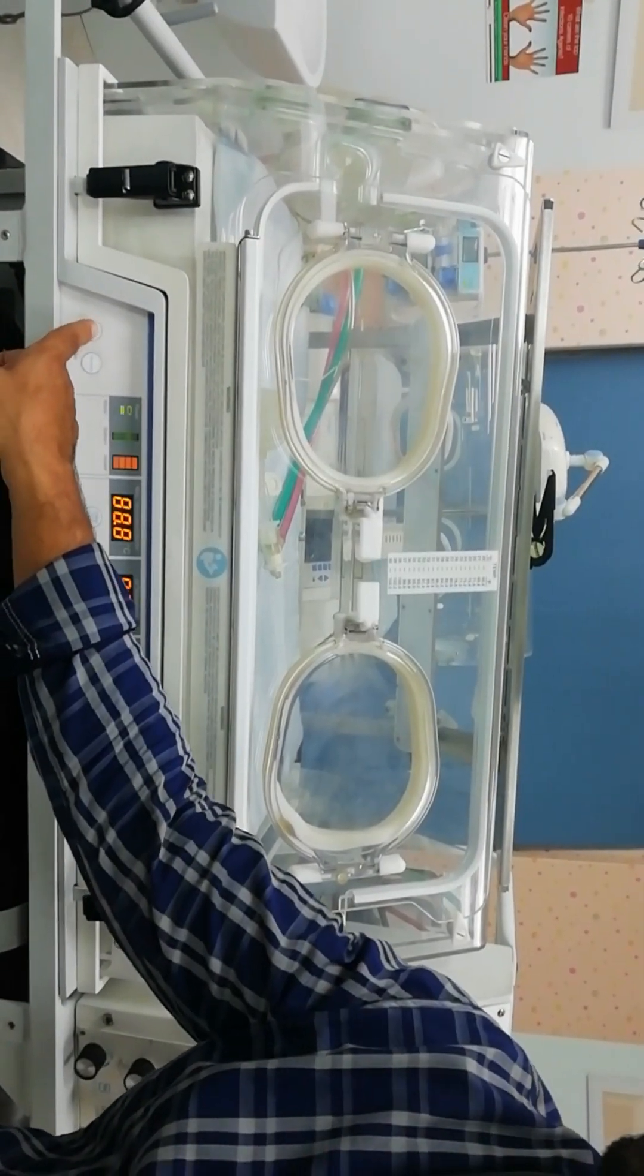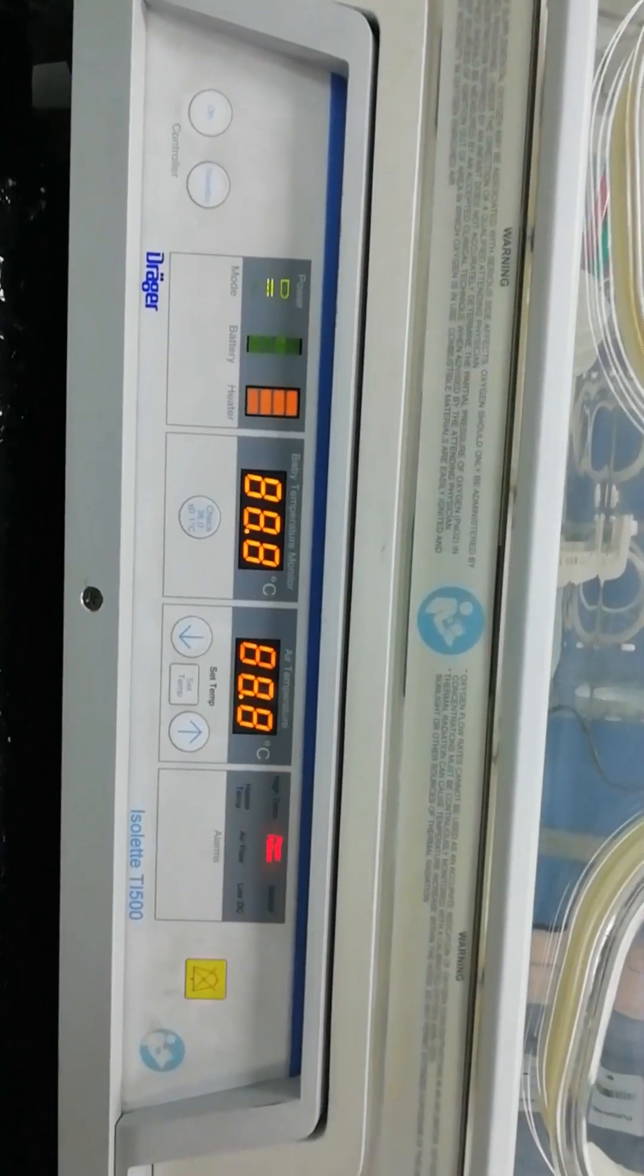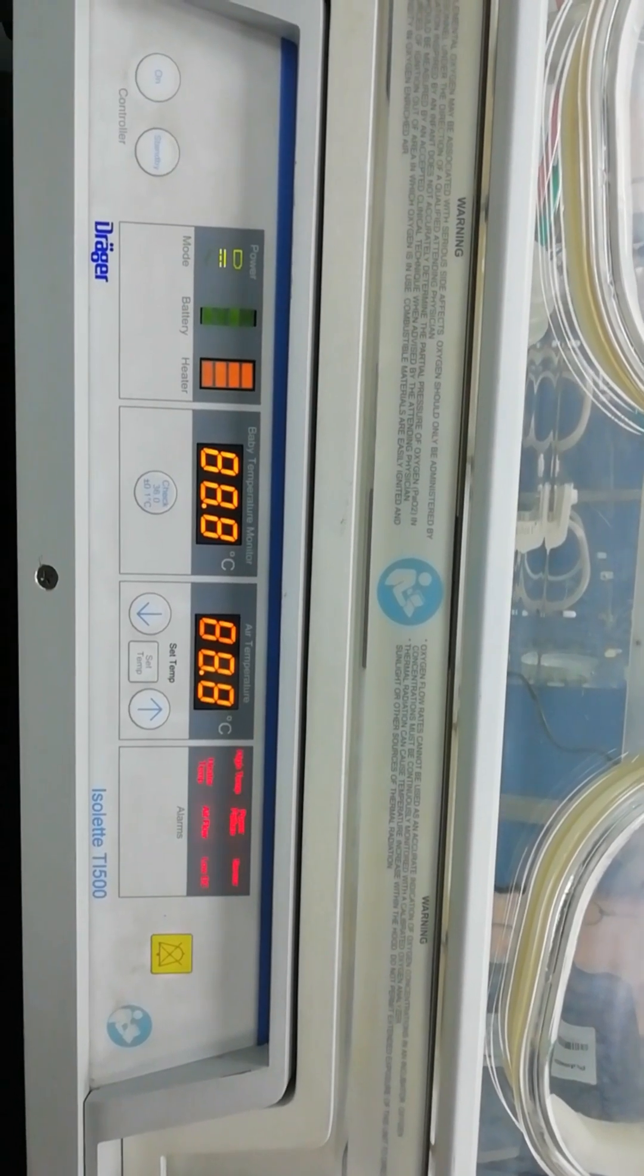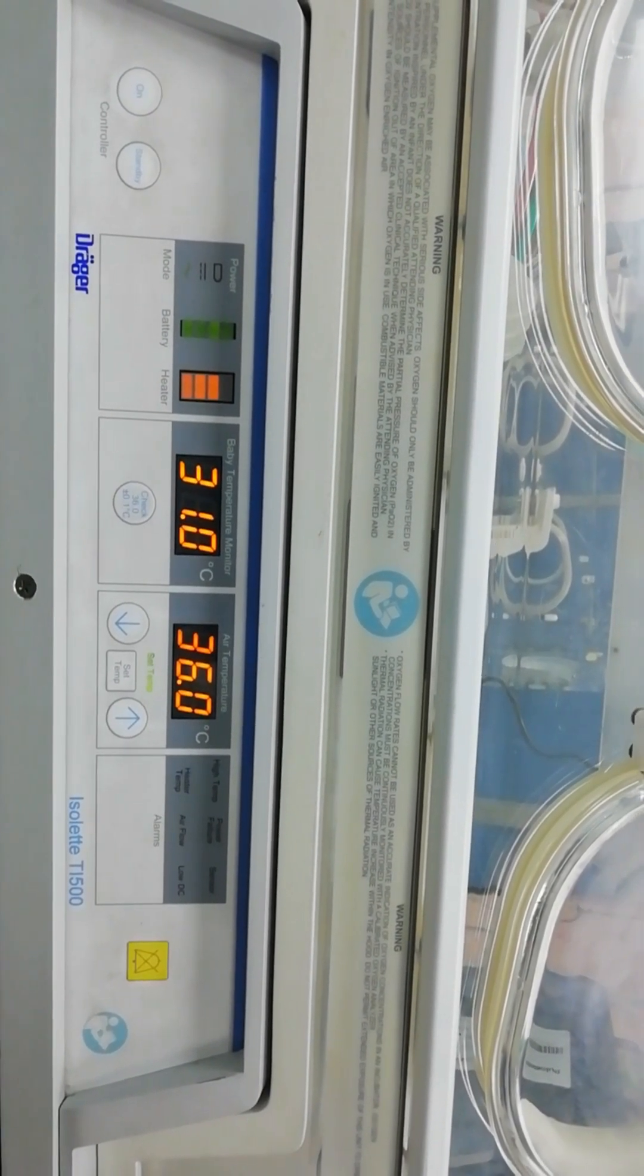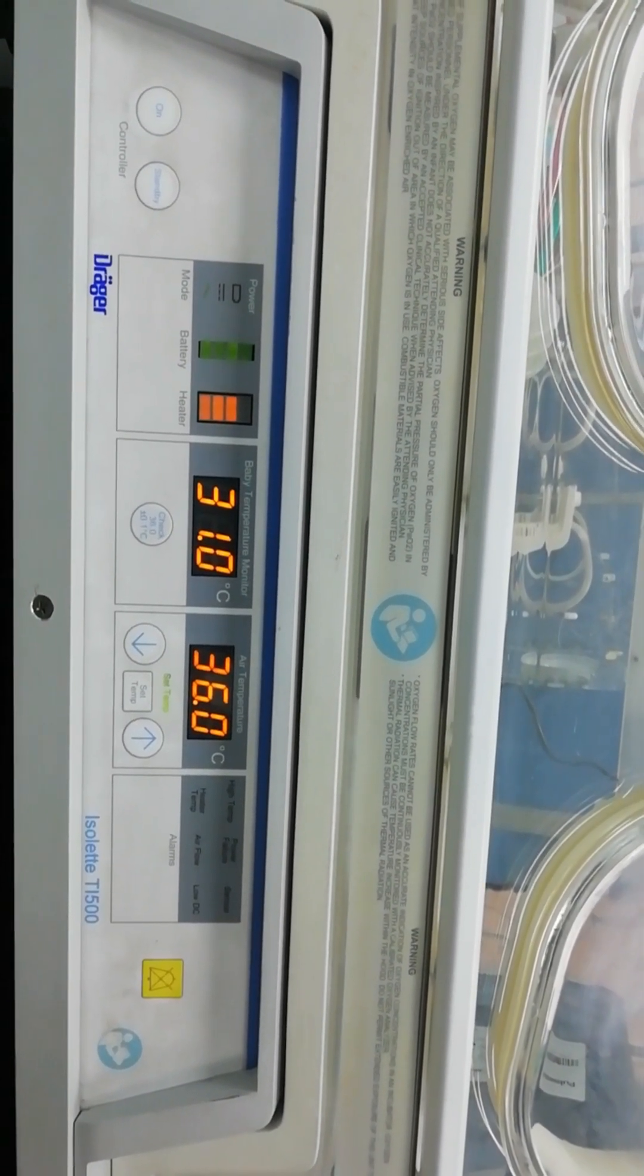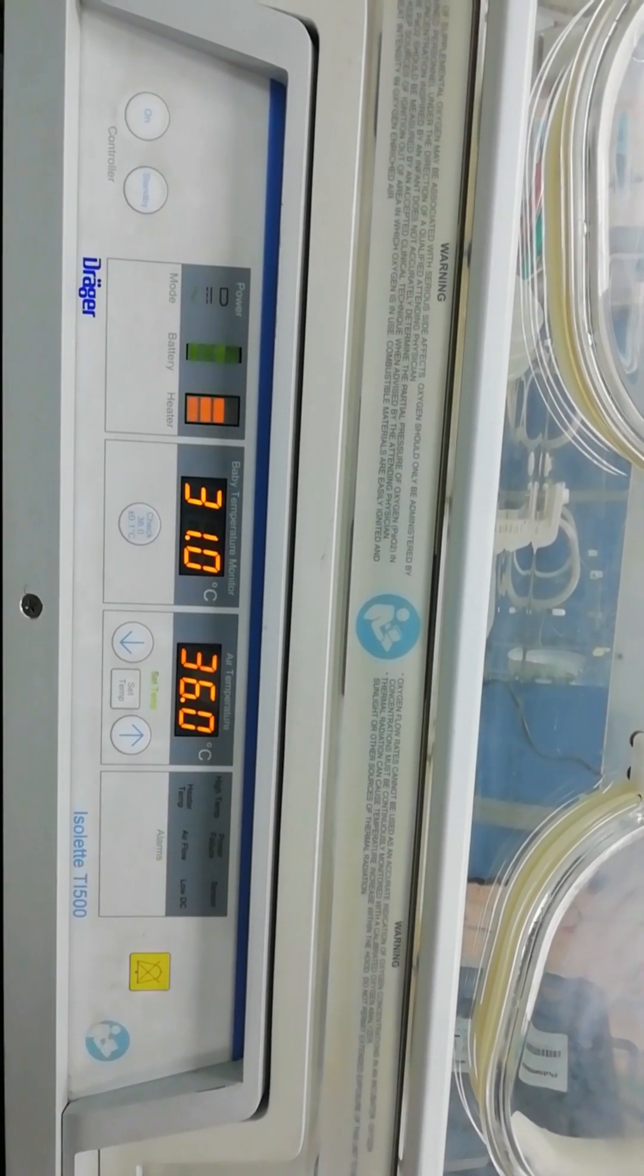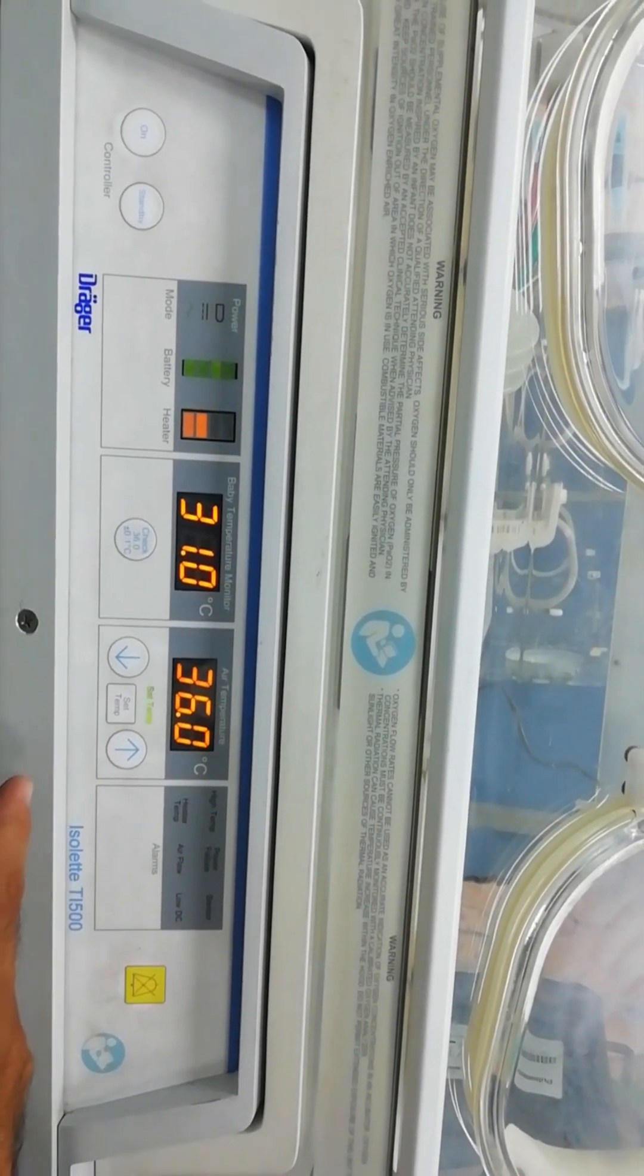The system is going to do a self-test that is around seven seconds. It tests for the sensor, airflow, the power, and the temperature. Now we can set the desired temperature for the transport incubator by setting the temperature over here.